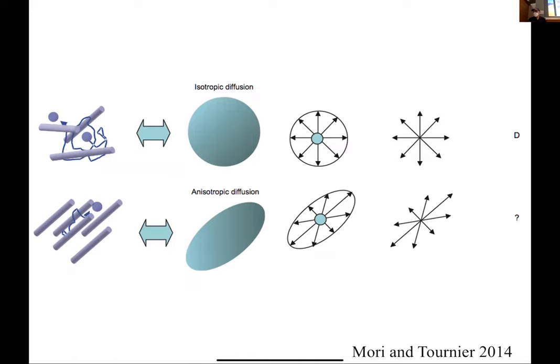Now we're going to get into one of the cooler aspects of MRI, which is how you actually use MRI to map the wiring in your brain in vivo. What we're going to do is build up some intuition about what's called DTI, diffusion tensor imaging.